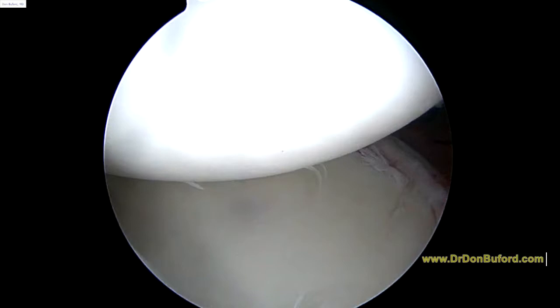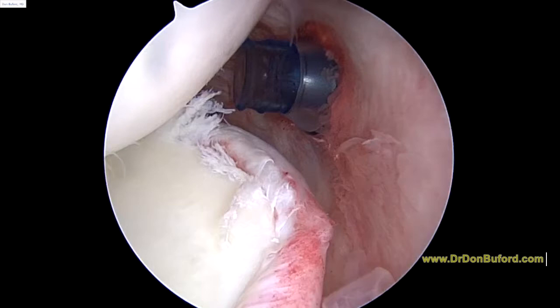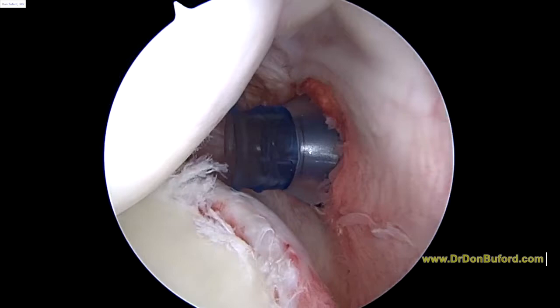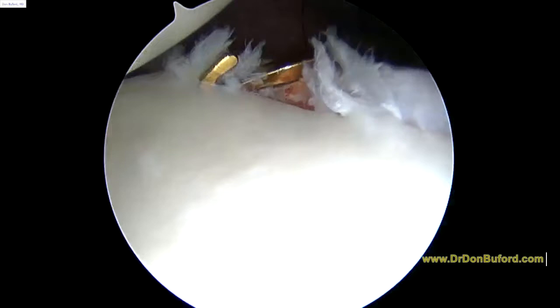Now we're looking from the front to the back. We've got our cannula in there. I'm going to slip around the biceps like that, and so now we have a pretty good look at this posterior labral injury. We'll take our curette — what we call our co-shave — just to give you an idea of the size of the injury. So that's certainly torn.